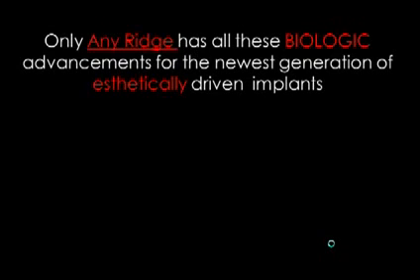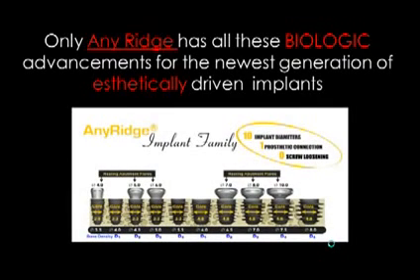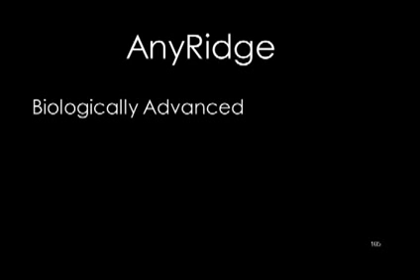Okay, so bottom line, in a nutshell, everything we just talked about, the AnyRidge system has all these biological advancements for the newest generation of aesthetically driven implants. We talked about why that is the case. If you do have any questions, you can always call me, email me, whatever the case may be. But in summary, the AnyRidge truly is biologically advanced.